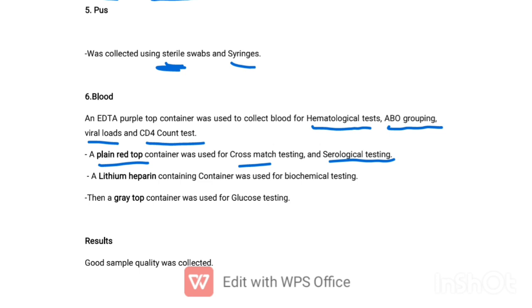We can also have lithium heparin. This is the container that is mostly used for biochemical testing. It has an additive, which is lithium heparin.